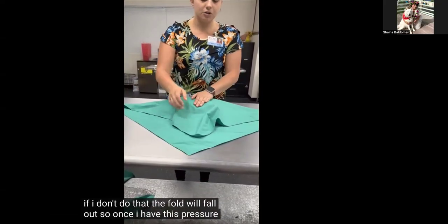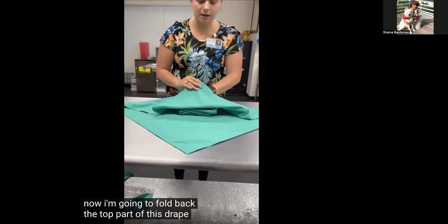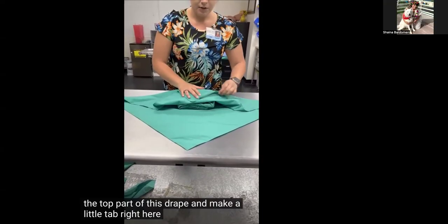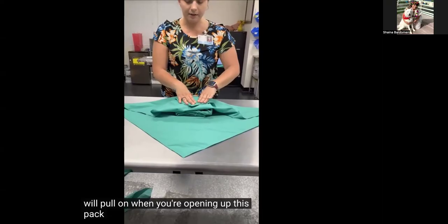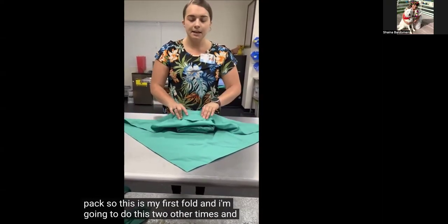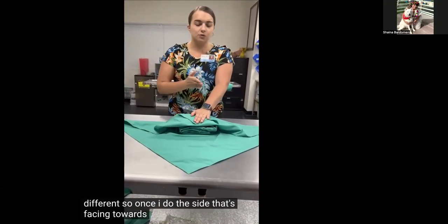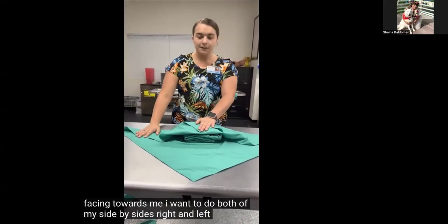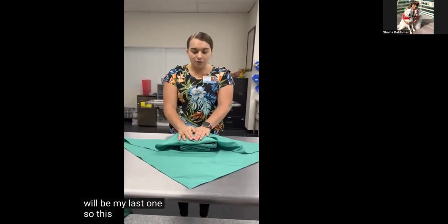So once I have this pressure here, now I'm going to fold back the top part of this drape and make a little tab right here. And that's what the doctor or yourself will pull on when you're opening up this pack. So this is my first fold, and I'm going to do this 2 other times, and then my last fold will be a little different. So once I do the side that's facing towards me, I want to do both of my side-by-sides, right and left folds, and then the side facing away from me will be my last one. So this is my first one.